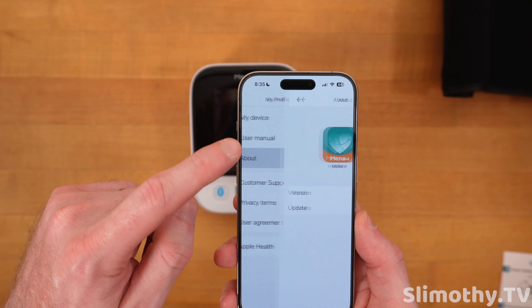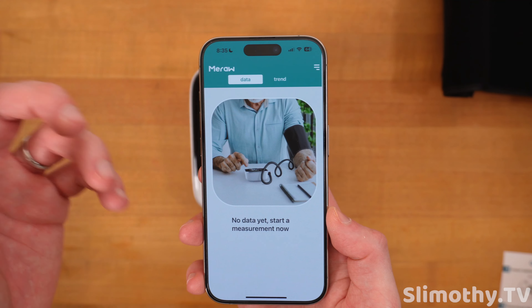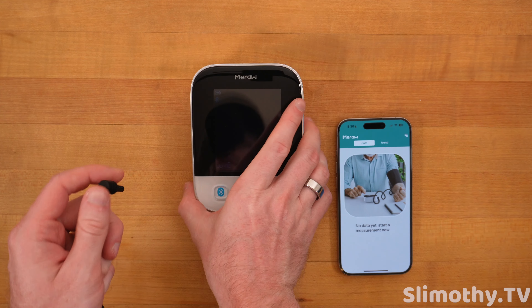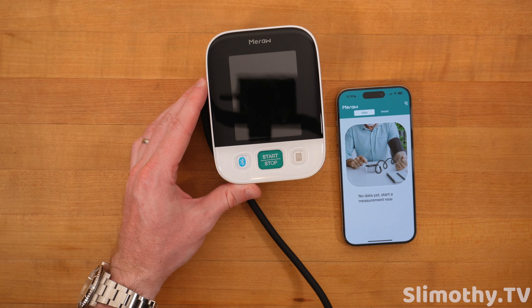It looks like there's a user manual right in the app — in case you lose yours, which is really clean. In the About section, you can even turn on Apple Health integration. We've got data and trends.